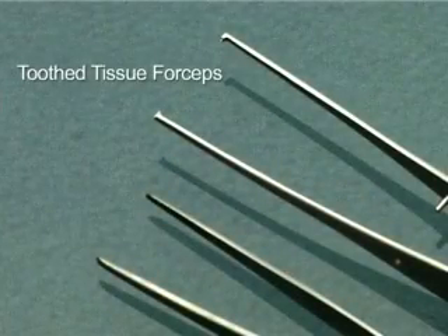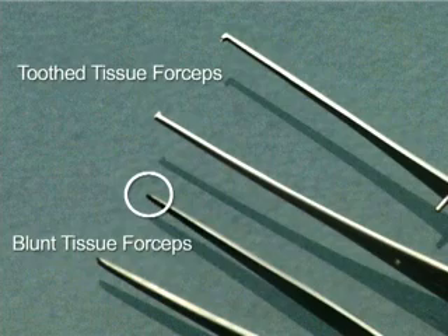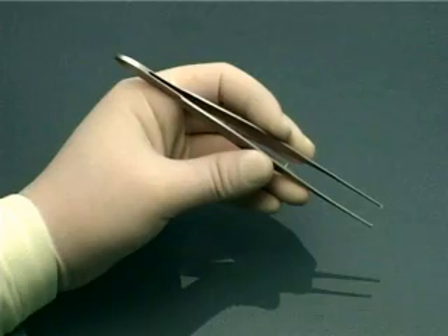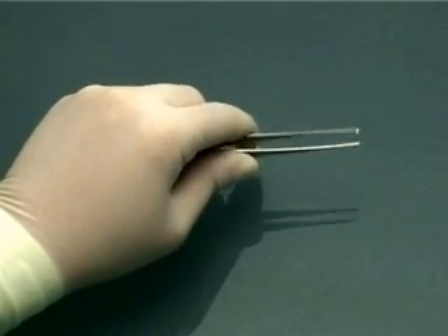These are tissue forceps. They may either be toothed, to aid in holding tough tissues such as skin, or blunt, to hold more delicate tissues such as the bowel wall. The proper way to hold a forceps is like holding a pencil. Do not hold it in this fashion — that's for stabbing your enemy.